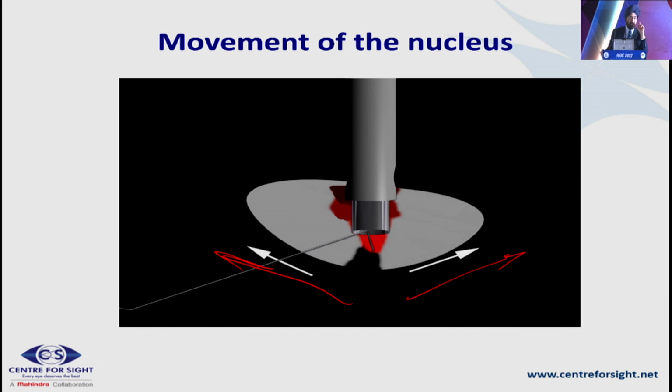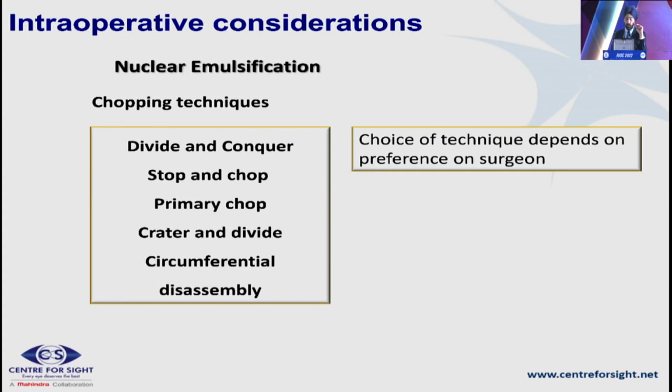So the important key message that I want to give you is that the depth of the trench is very, very important, and the placements of the two instruments by which you are going to crack it or split it, that needs to be down below so that you are able to do this.